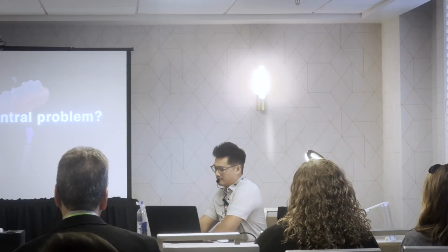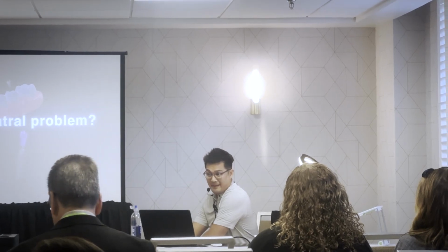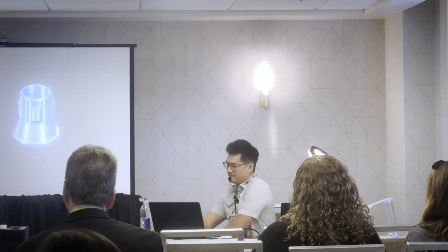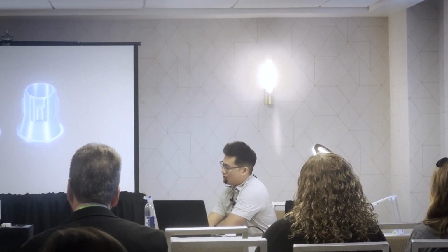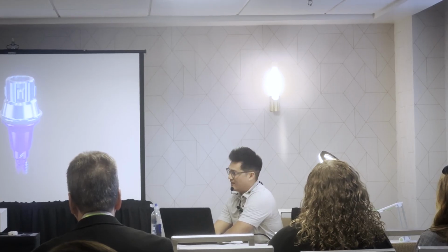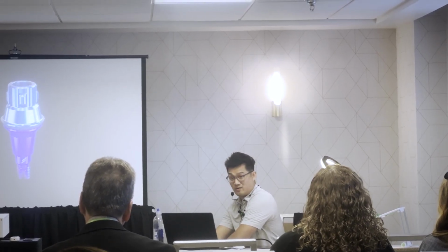So what's the central problem for us going from digital to making something? The central problem is tie bases. And the issue isn't really tie bases themselves. If you look at the national average survival rate on zirconia double-arch cases, it's about 98% over 10 years. And all of those 2% that fail are almost all tie-base debonding. So it's a very, very small amount.